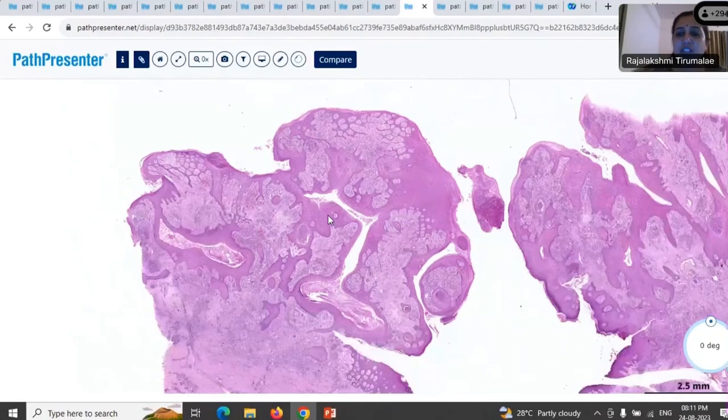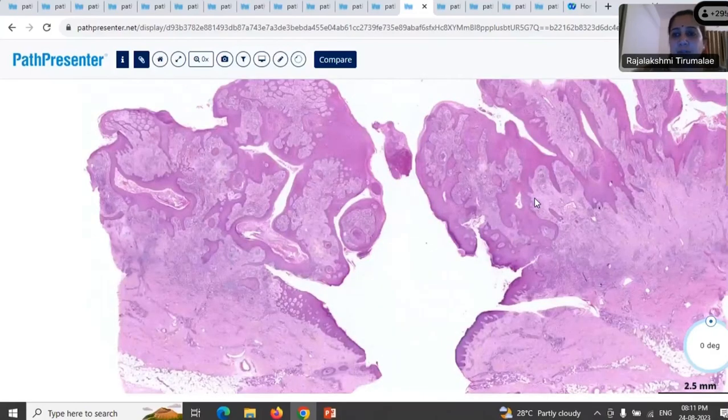So in such a case, if you're suspecting tuberculosis, would you do a Ziehl-Neelsen stain? If you're suspecting lupus vulgaris or TBVC, ma'am, is it worthwhile doing a ZN stain? No, usually your ZN stain is going to be negative in such instances. So in this case, it's very fortunate that we found the fungi, and this is a very nicely done biopsy.